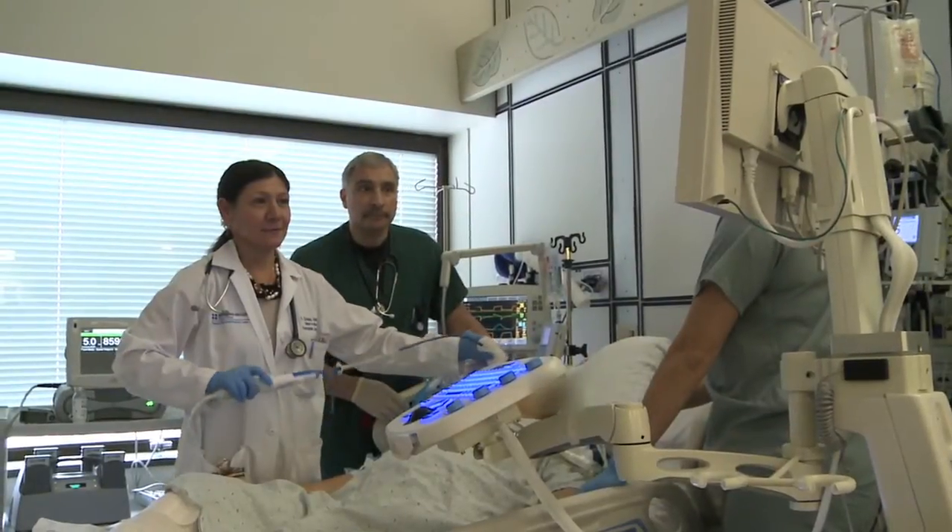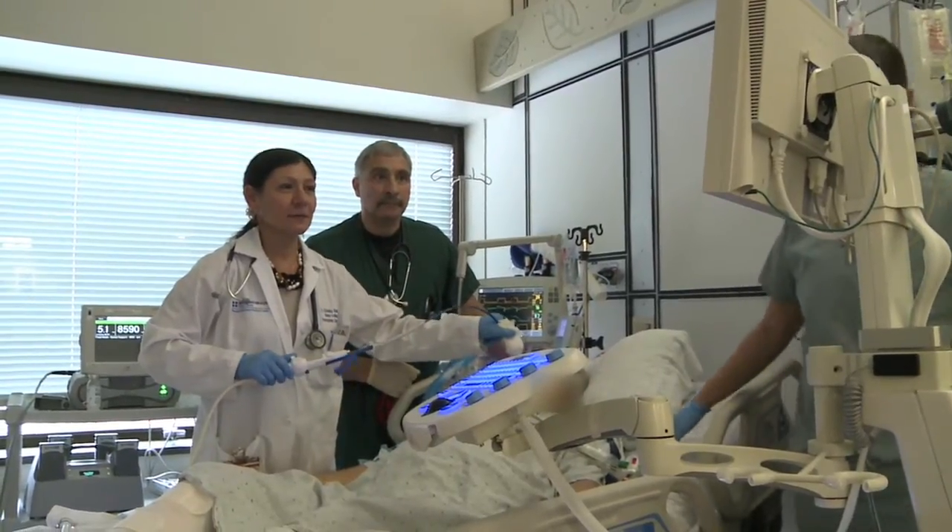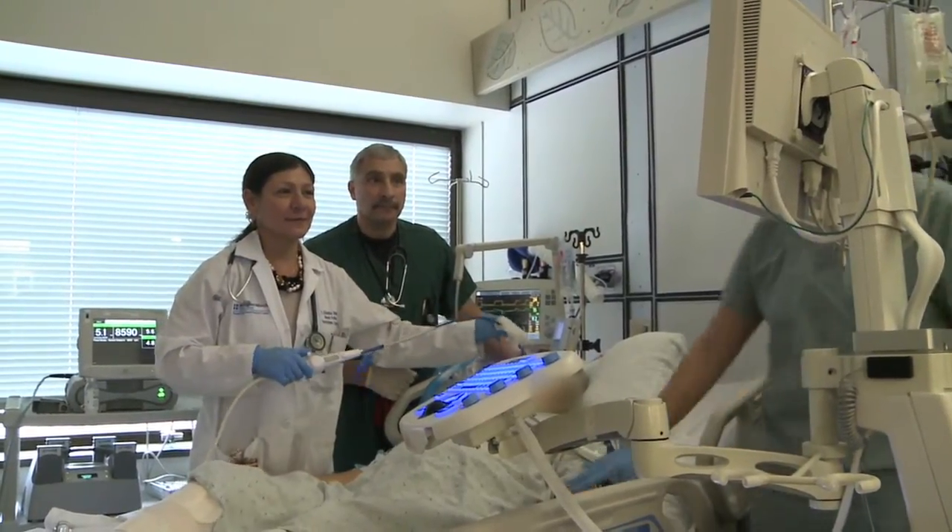After the operation, upon arrival in the ICU, we inserted an Imacor probe, which we do in all our VAD patients. For the first 12 to 24 hours, we have an indwelling probe that enables us to adjust the speeds, optimize them, and also to diagnose any problems that may arise, such as tamponade or right heart failure, before they become clinically significant. What you will see is Dr. Gadea doing that immediate post-op transesophageal echo using the small Imacor probe.